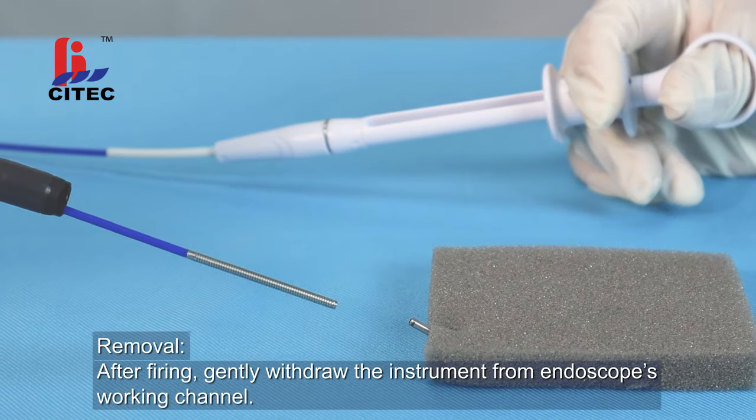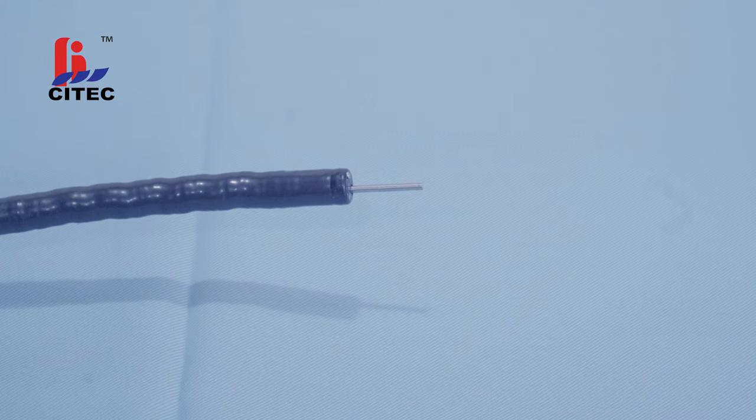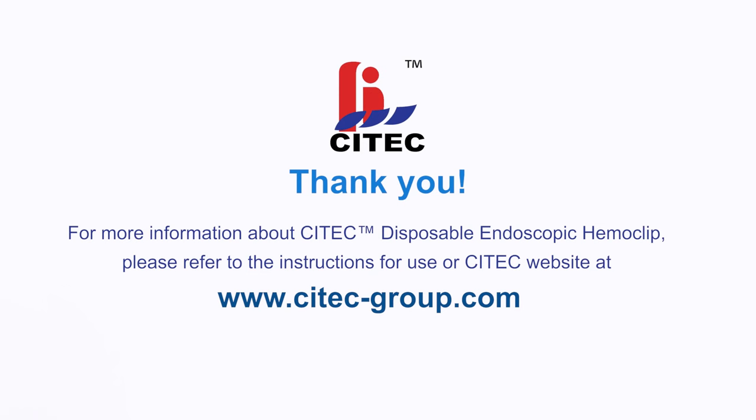After firing, gently withdraw the instrument from the endoscope's working channel. For more information about the CITEC Disposable Endoscopic Hemoclip, please refer to the Instructions for Use or the CITEC website at www.citec-group.com.